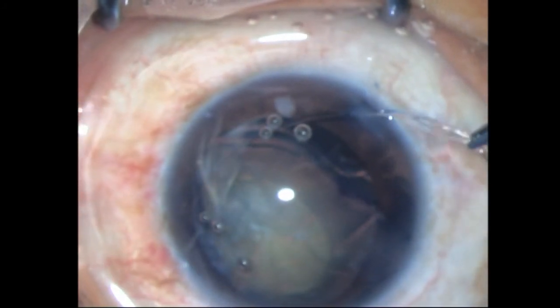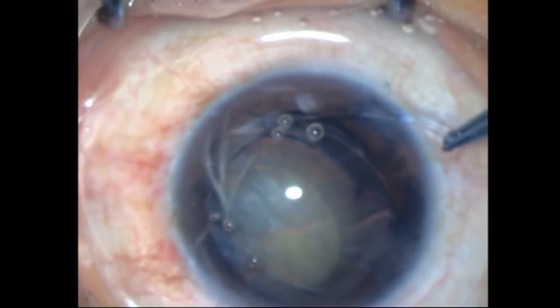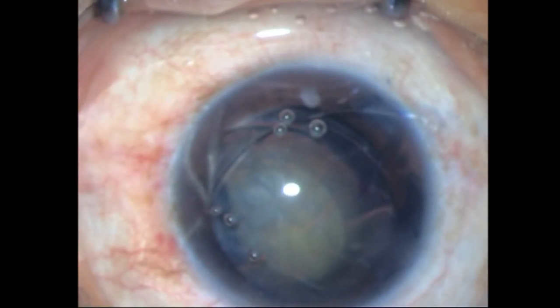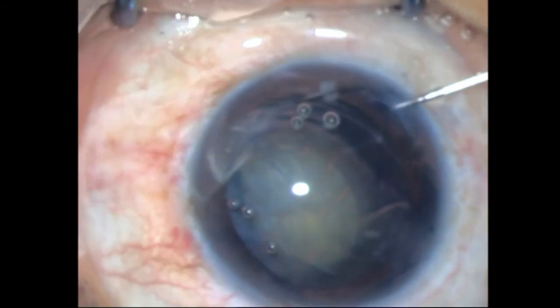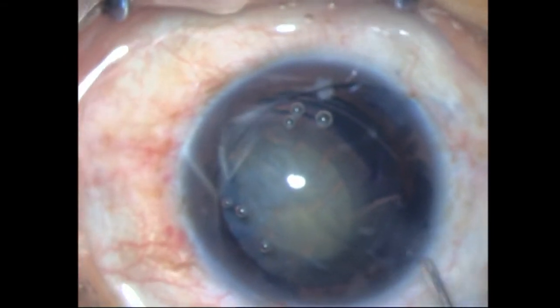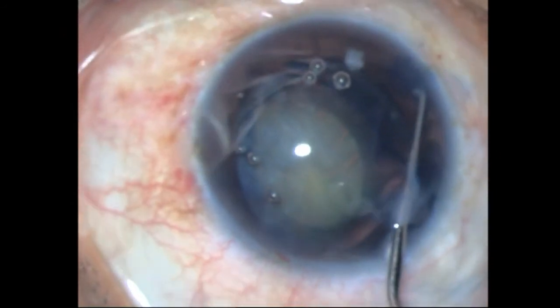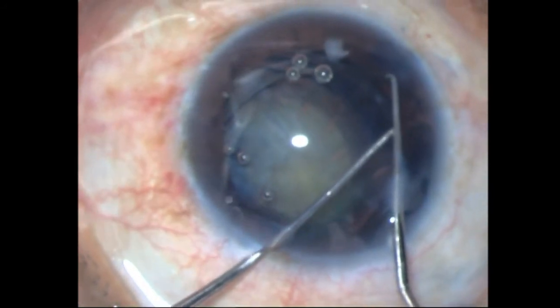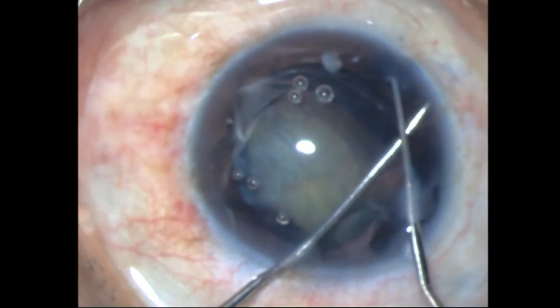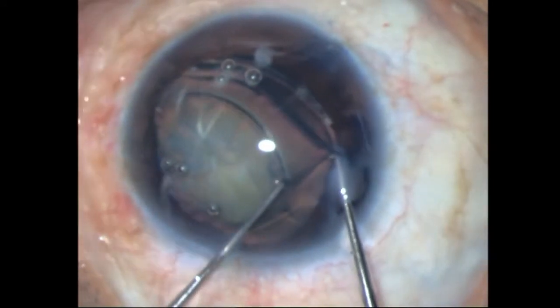You can see the ring going across the colobomatous area. Now getting the other eyelet into the bag is going to be a challenge — I'm doing it with my two-dialer technique. I hook one of the eyelets, try to get it in, and I lost it. So I retrieve it from the angle, bring it into the mid-chamber, and with my other dialer I hook the eyelet once again. It's a little awkward because it has to be done bimanually, however I got it in — I tap it into place and that's it, it's in.